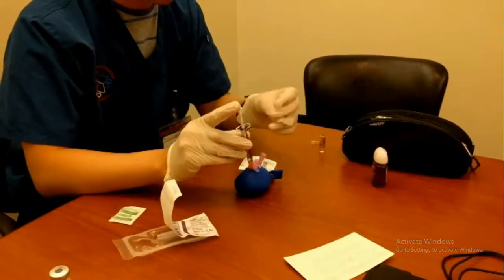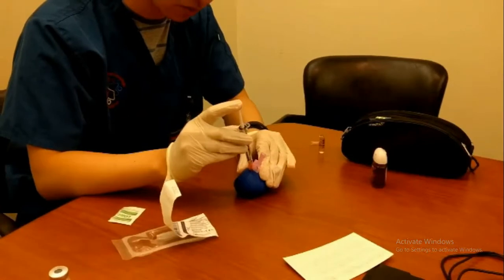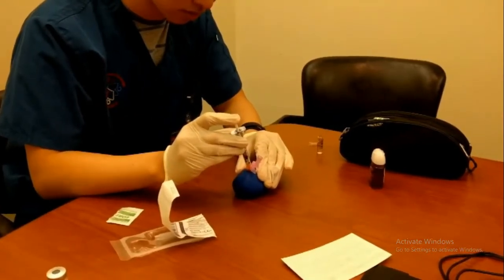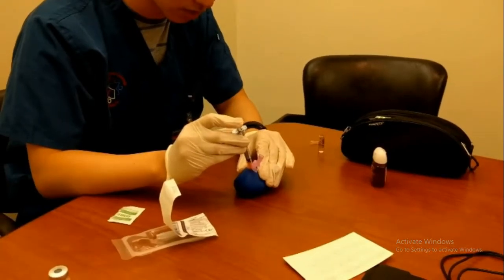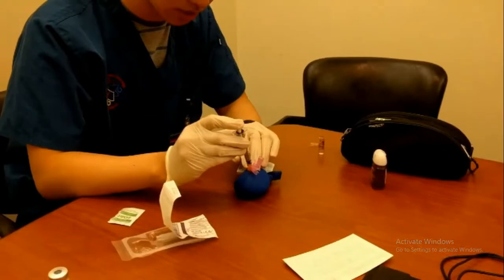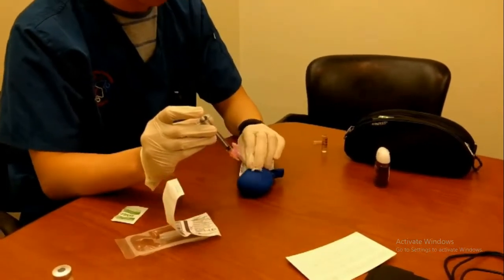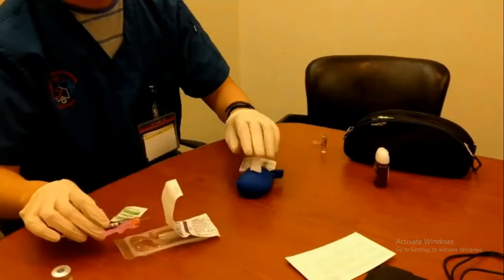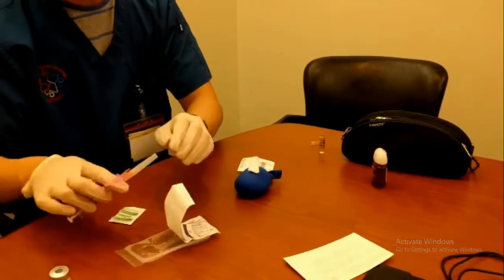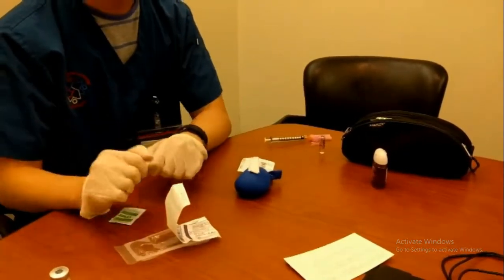And originally I would have the gauze between my 3rd and 4th finger, and I will be slowly injecting the fluid. Then when I'm done, I will be putting the gauze that would be there, and then slowly removing the needle and asking them to hold it. And then I would put this back into the cap and would put the whole needle into the sharps bin.